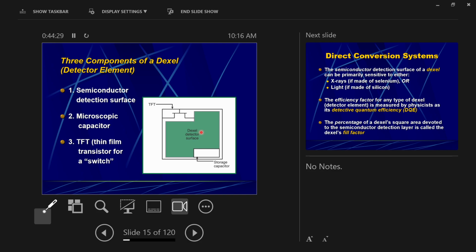That's what the word semiconductor means. It means it kind of conducts electricity, okay? Or, and this is more of what we mean, a semiconductor will conduct electricity under very specific circumstances, such as when the right kind of light hits it, okay? So semiconductors, there are many different kinds. Silicon is a great example of a semiconductor. But semiconductors, which your phone detectors are made of, the detector cells on your phone, the detector cells on these imaging plates, are made of materials that conduct electricity under very specific circumstances, okay? Like when they're exposed to the right kind of light.